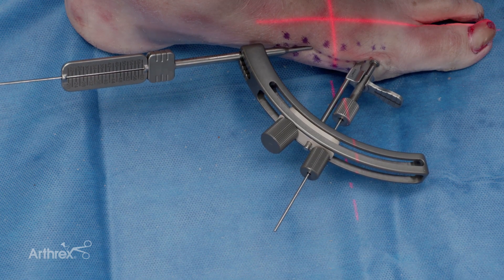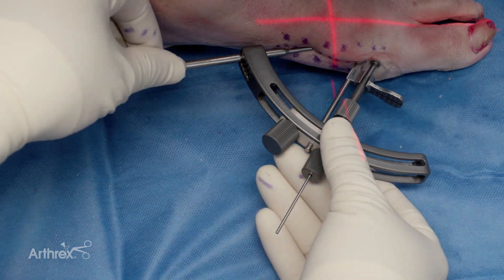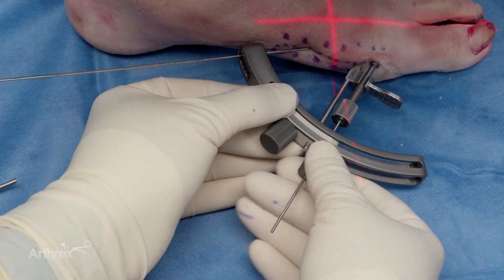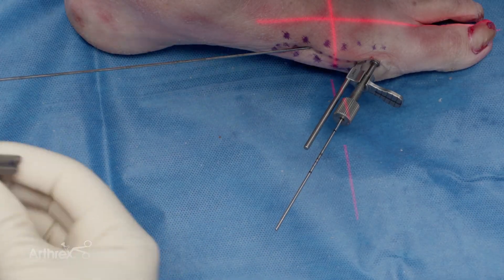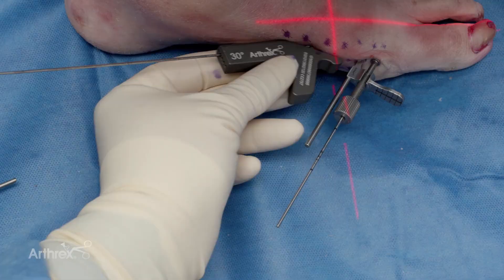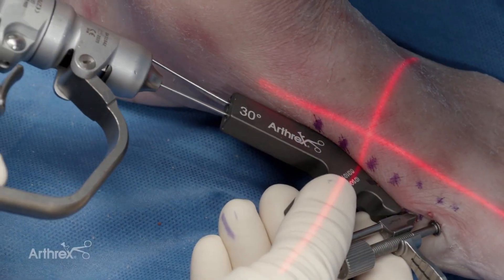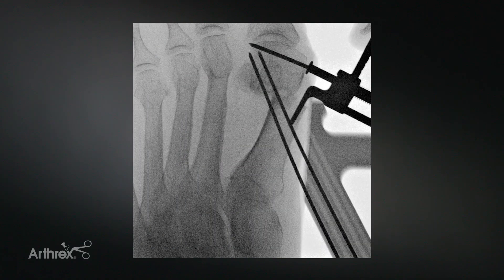Another use of the parallel guide is in conjunction with the trajectory guide that accompanies the shifting device. If you're having success with one wire but difficulty placing the second, you can use the already-passed wire with the parallel guide to help place the second wire — skipping one spot in the guide. In this fluoroscopic image, we can see the 30-degree guide has helped with placement of the distal screw.